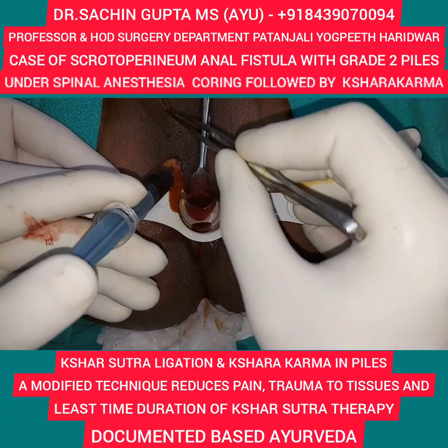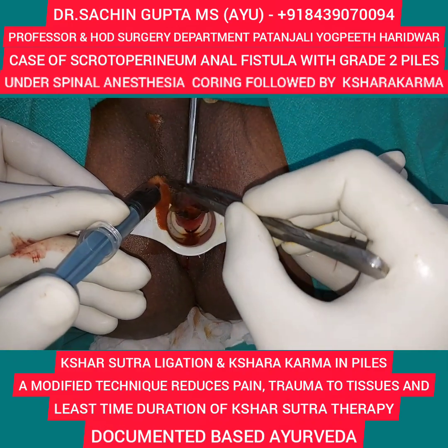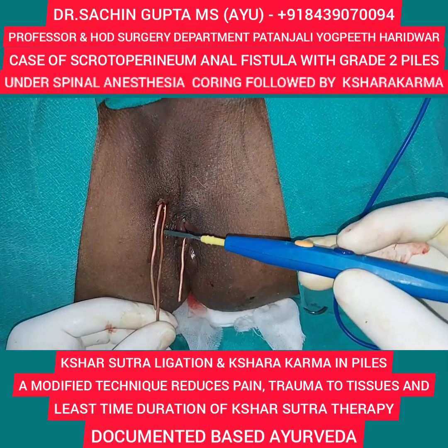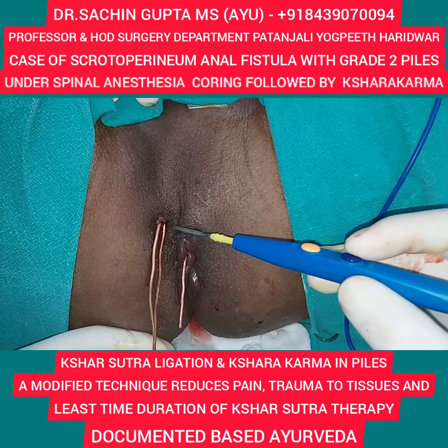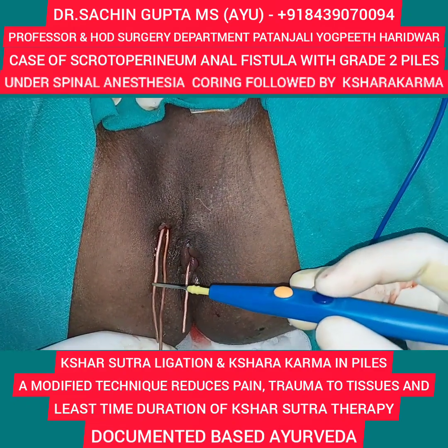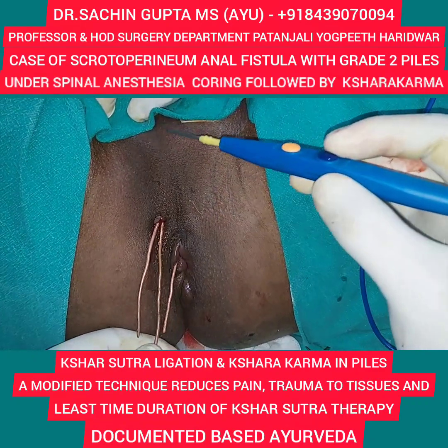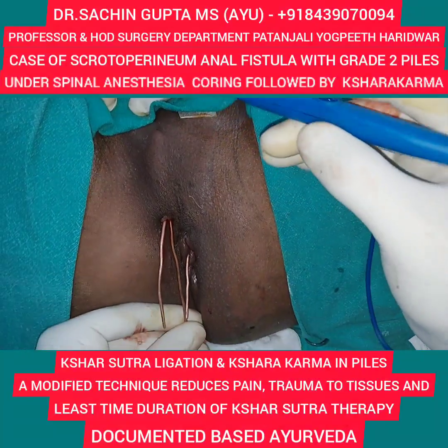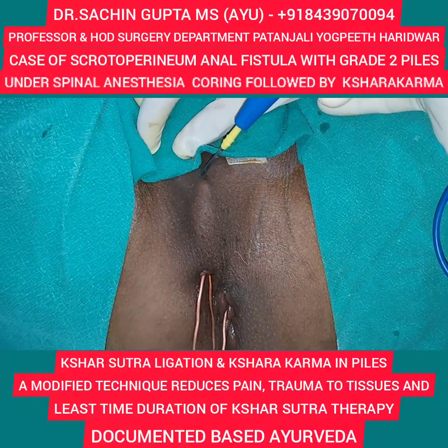So this track is like this. It is moving like this. So it is an L-shaped tract. Probing is done in both the tracts. That is, in one tract which is going in the anal canal, and from this same external opening, that is extension up to the lower base of the scrotum, we are creating another opening with the help of cautery.